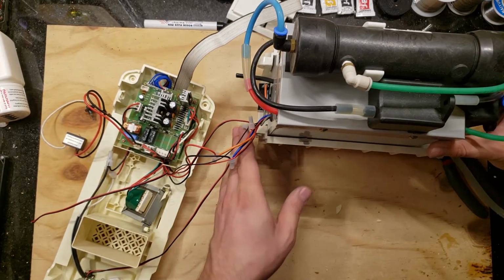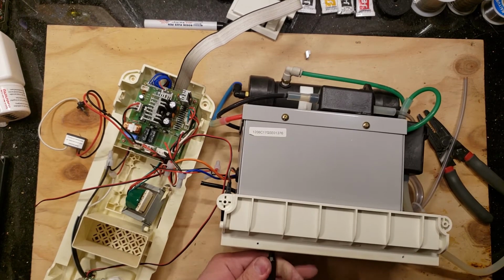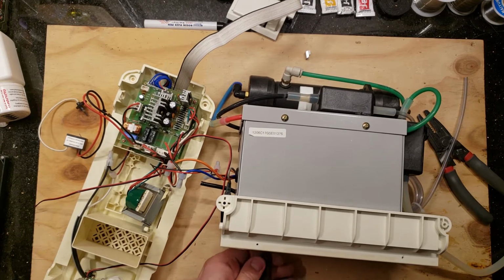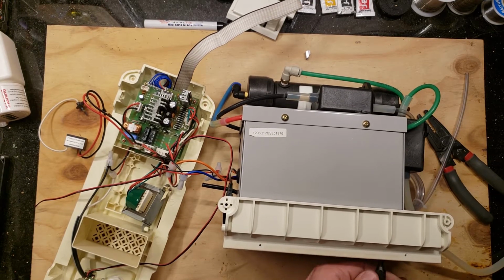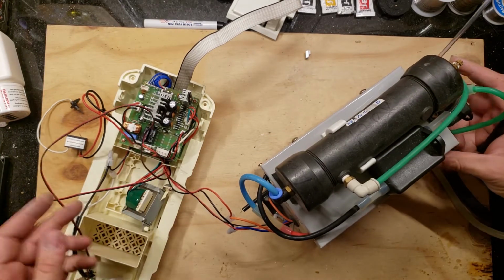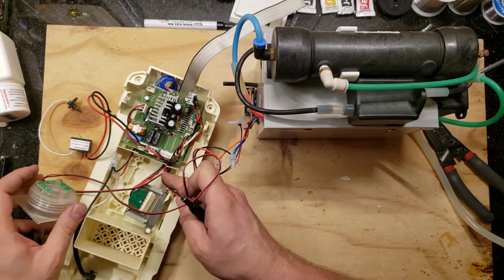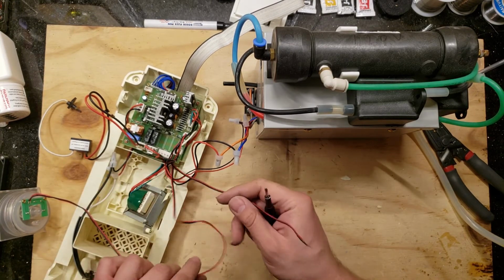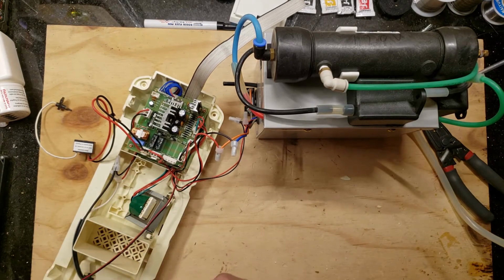So let's move this a little bit. Actually, let's see if this will unbolt. That way I can get rid of the plastic piece and make this more compact. Alright, so all the magic is happening in here. This thing here. Oh, this plastic is super, super brittle. So we don't need this LED, so let's unplug that. I'm going to put that away.